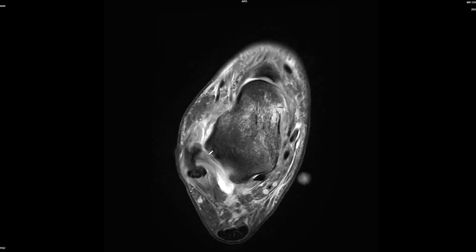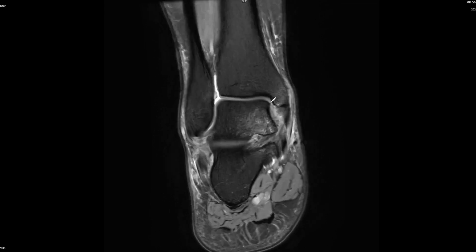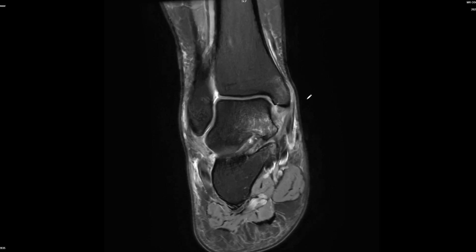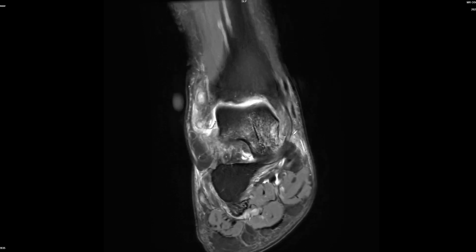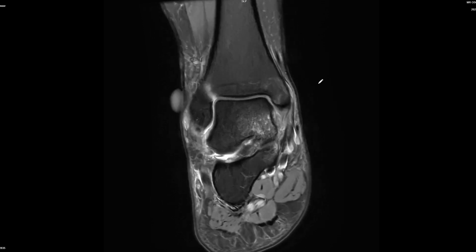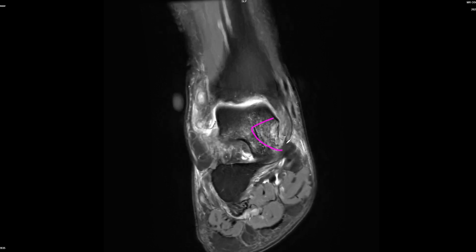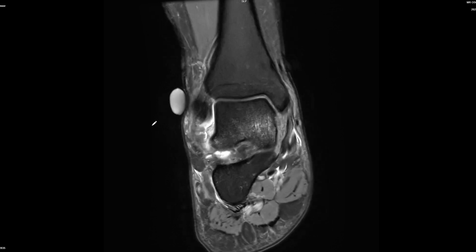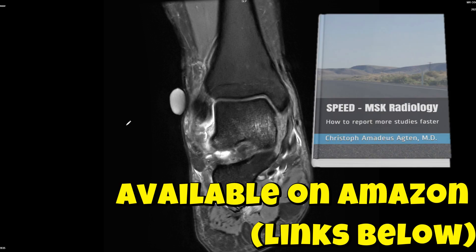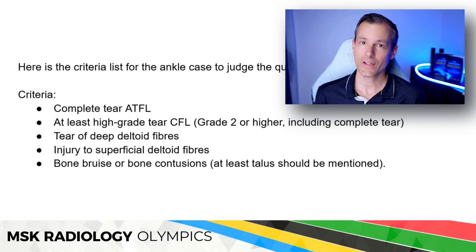Ultimately the conclusion was a complete tear of the ATFL and CFL as the two major ligament tears. I also wanted documentation of a tear of the deep deltoid fibers, something about the fascial sleeve avulsion or periosteal stripping, or anything wrong with the superficial deltoid ligament. I also wanted the bone bruise or impaction fracture at the talar neck to be mentioned. Those were the key criteria.